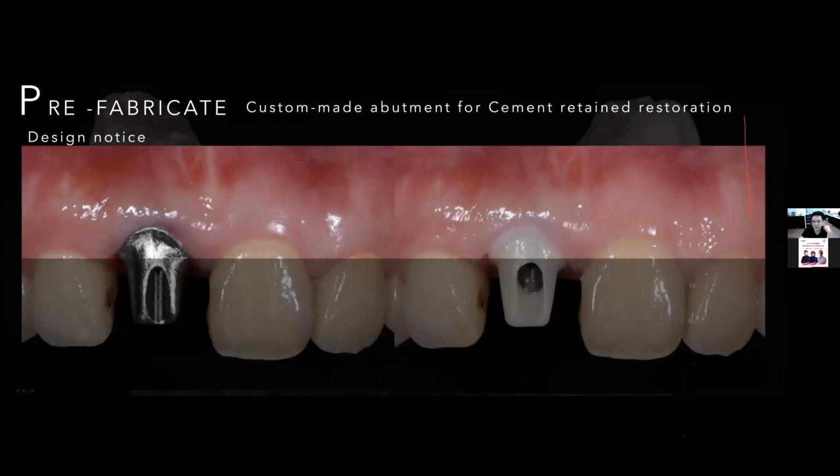And this is interesting: with the same patient, we made two different cosmetic abutments. One is a titanium abutment, and one is a zirconia abutment. And you can see it is interesting. I think the margin is also the same design, but we can see it is totally different. The zirconia abutment looks very smooth and more harmonious. But with the titanium, you can see a very significant and clear margin line.